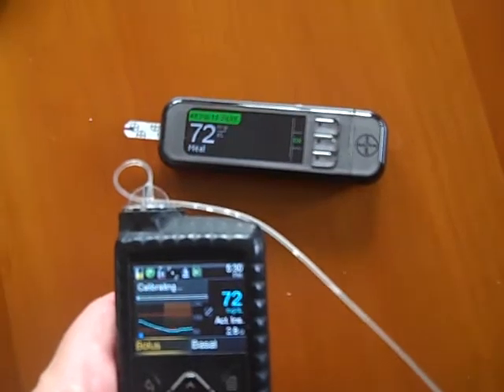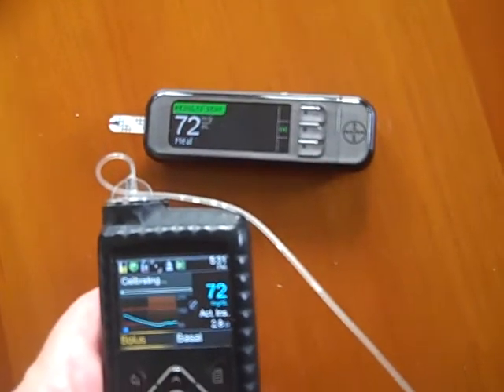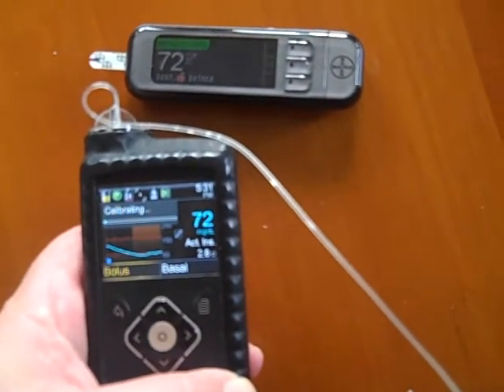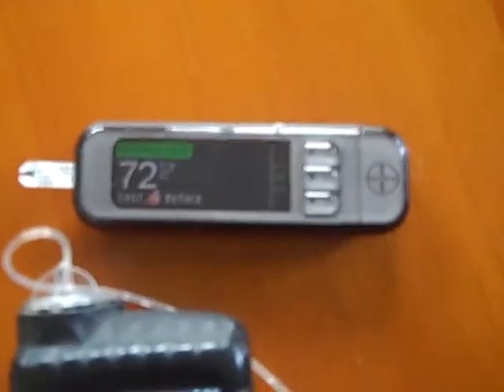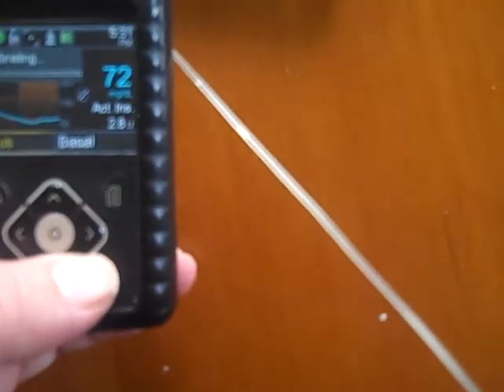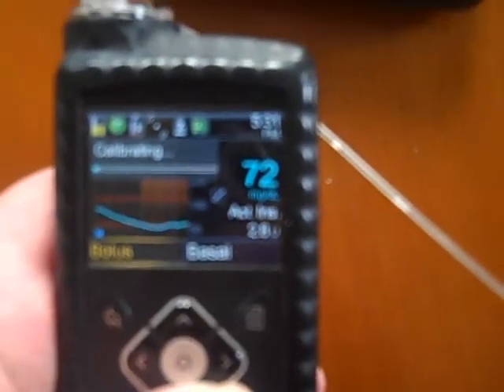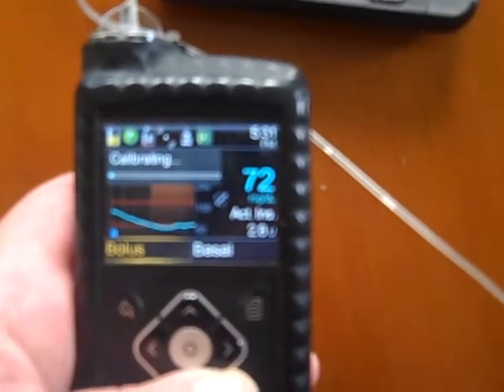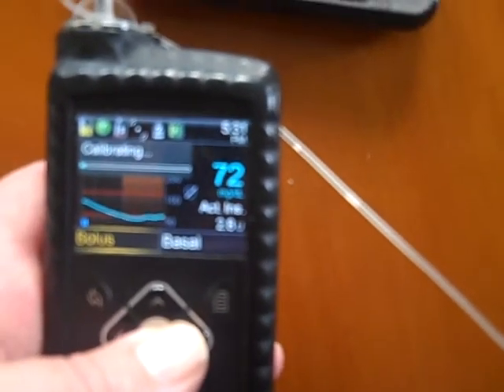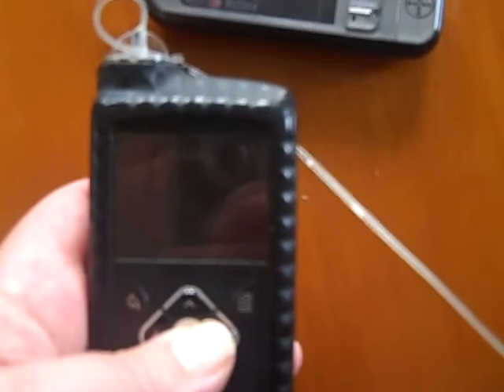Sorry, I had a technical error and I had to check my camera — as you can see it's actually exactly on. My glucose meter says 72 and my insulin pump sensor also says 72, so in this instance it's actually exactly matching. Now you can see it says 'calibrating' but there's nothing really to calibrate — it's actually exactly on at the moment, so it's pretty good.